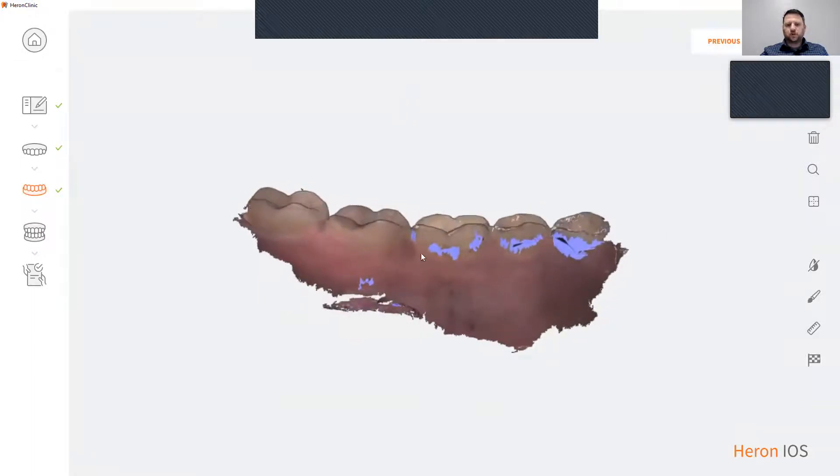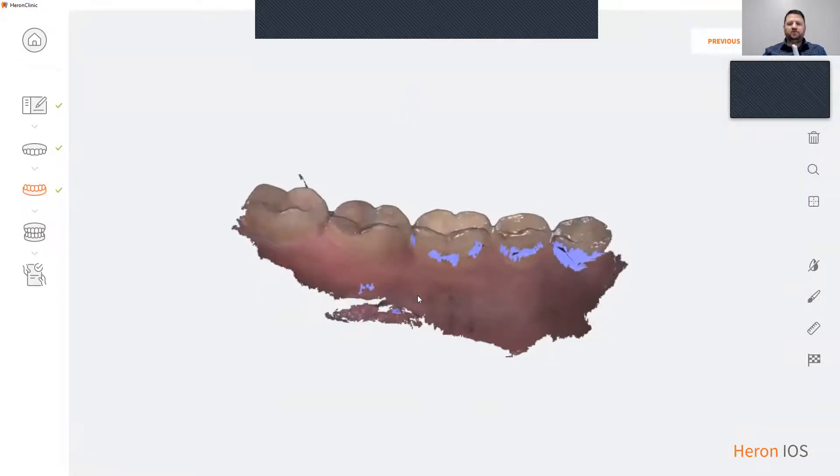If you notice the blue spots here, those are areas that need to be filled in. To fill those areas in, simply turn your scanner back on, go to those areas, and scan.